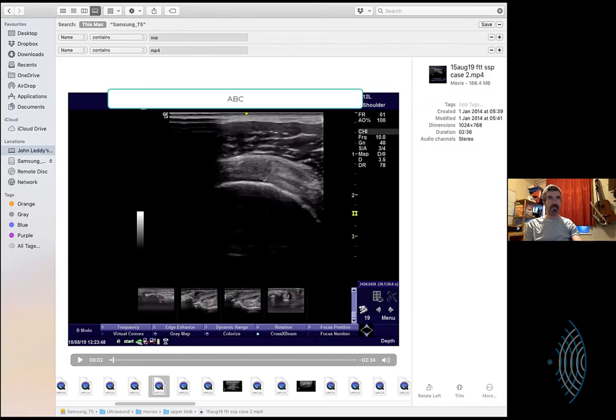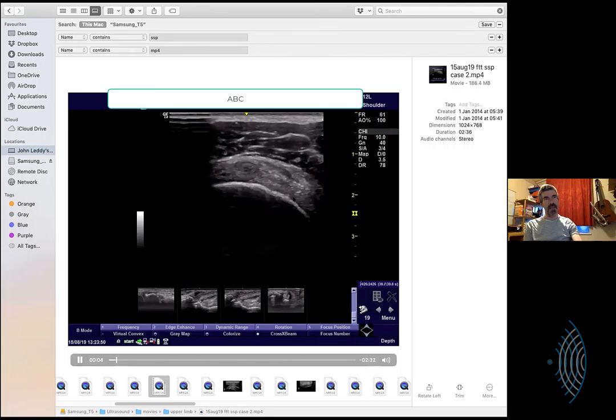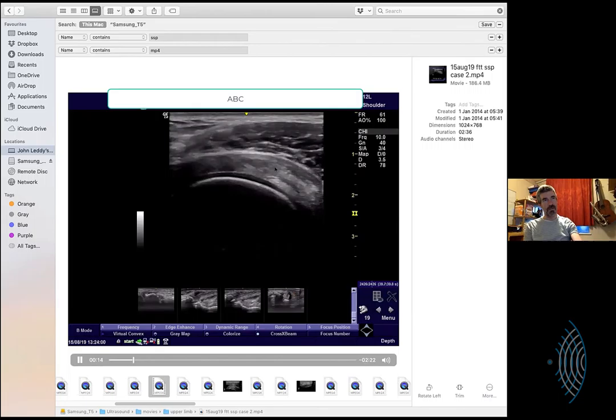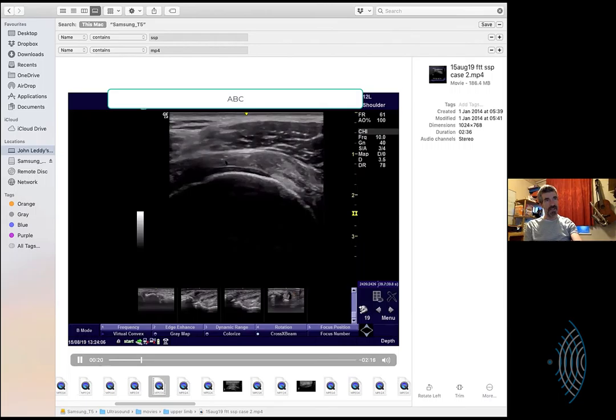May I have you also assure me that I'm seeing a homogeneous echo above the long head of the biceps in this image, and you would say that's the anterior component of the supraspinatus tendon predominantly, and the tear is in the posterior? No, this is a quite complicated scan. I'm not entirely sure what's going on there. I think that's the biceps there.